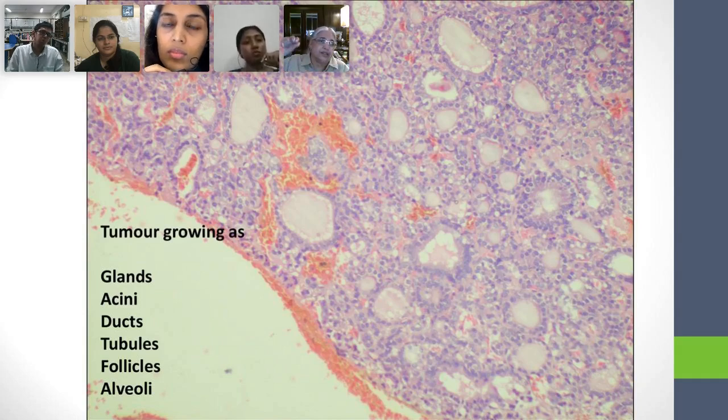secretory ductal apparatus. Okay, you cannot get an acinus, for instance, in the colon. You get glands in the colon, but the colon has no ducts. Do you understand that? There are no ducts. So if you have something that has a secretory apparatus with both a secreting portion and a ductular portion, which takes the secretion and dumps it somewhere else, then that terminal portion where the secretion is actually being made is an acinus.